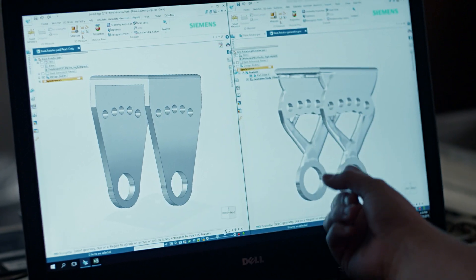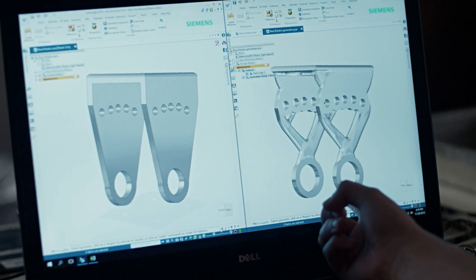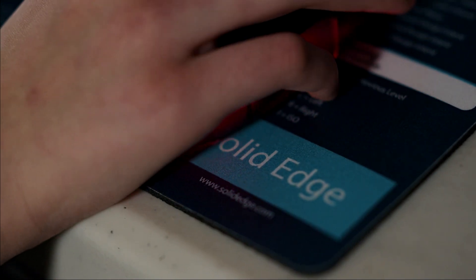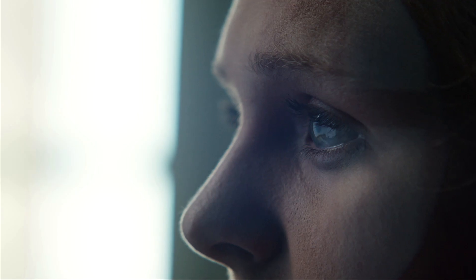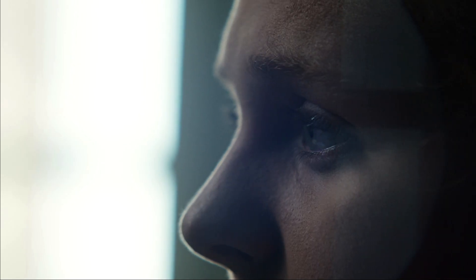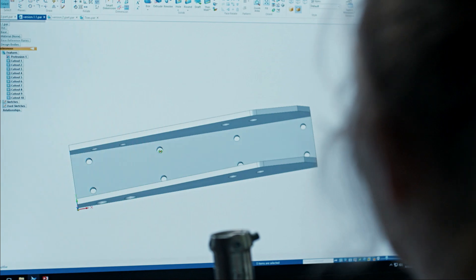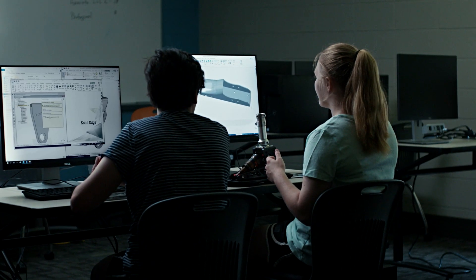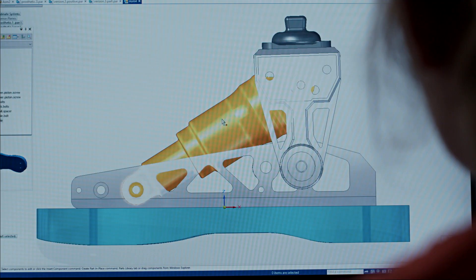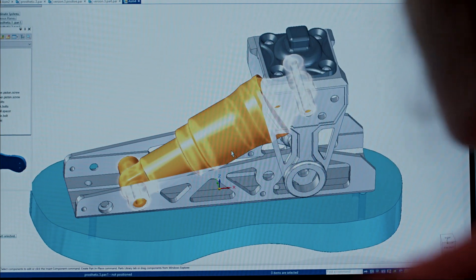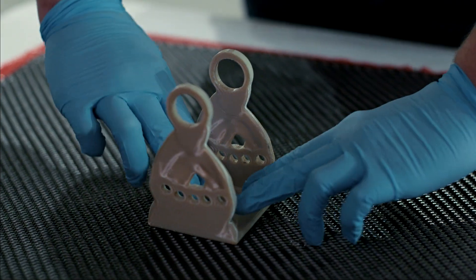Generative design is a feature of Solid Edge that is like artificial intelligence for 3D designers. We tell it a few things that we need, and then it takes all that information and decides what's going to optimize the part.